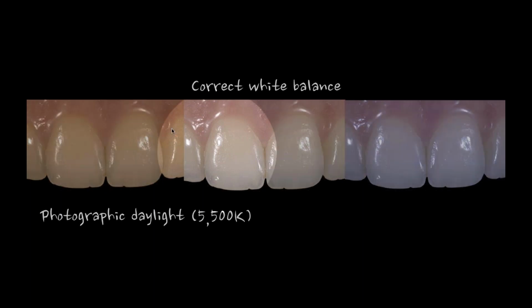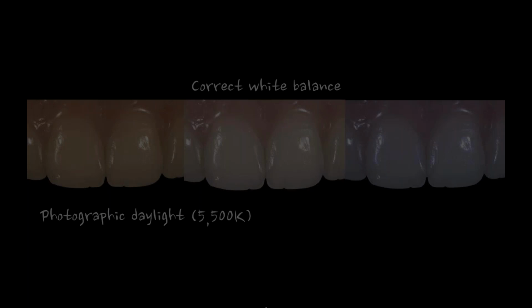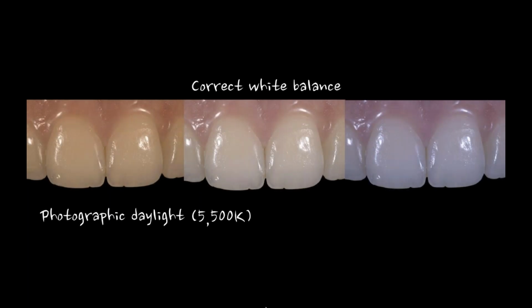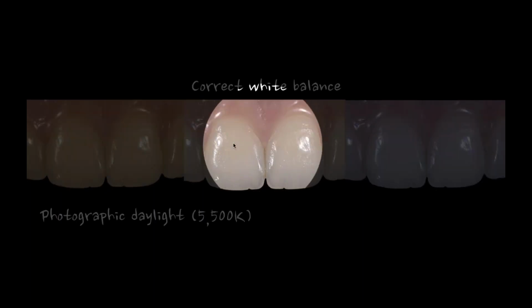So you'll notice that this correct white balance photograph in the center gives me what I would call the optimal color. This is technically about 5,500 Kelvin, although that could vary a little bit depending on the outside lighting and the camera that you're using. But I want you to notice that if I take the camera out of the box and I don't put all the settings in that I just told you about, what will tend to happen is this.